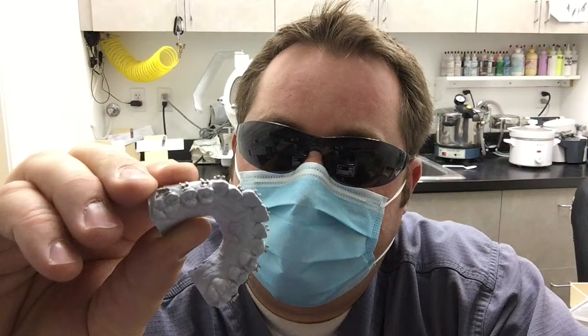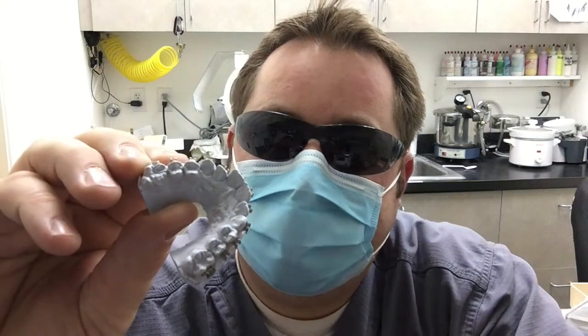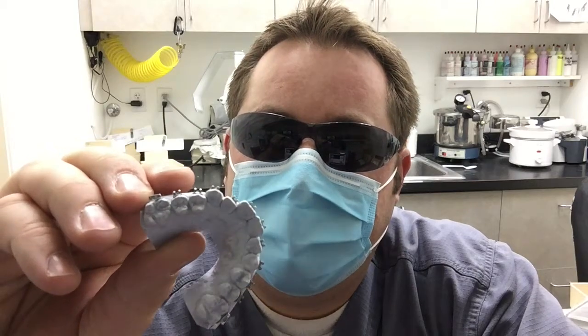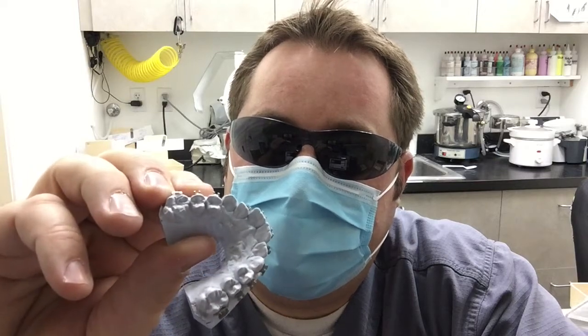Hey, Adam here. I have some time this morning and I wanted to do a video on indirect bonding. So you can see we've got a model, it's got some brackets on it, and we're going to make a special tray that goes over top of this so we can bond all these brackets on the patient all at once without very much doctor time. There are some things we need to do to this model and these brackets before we make that tray.